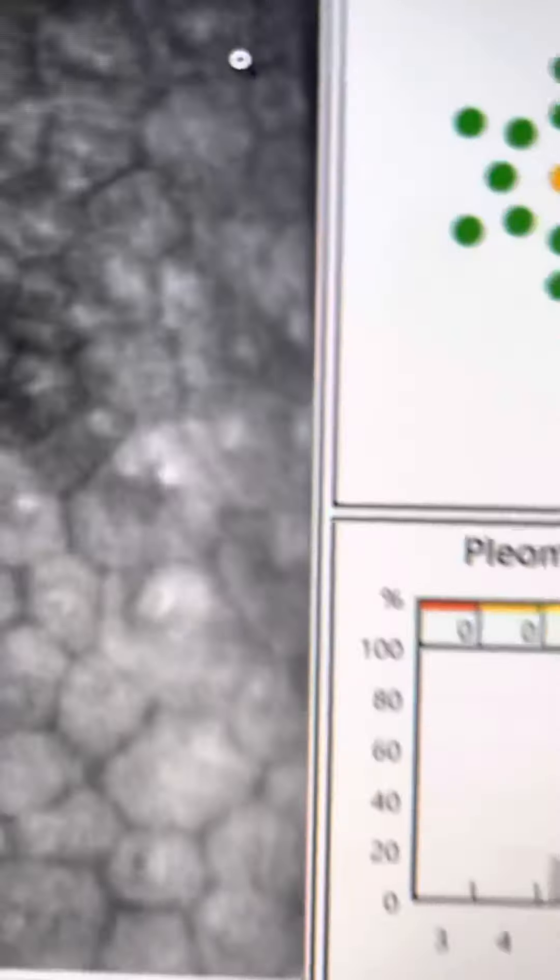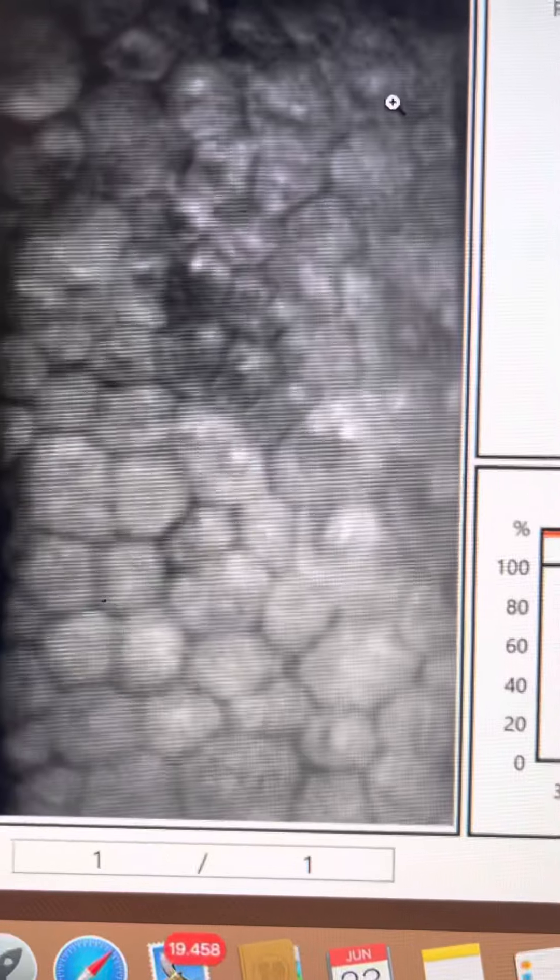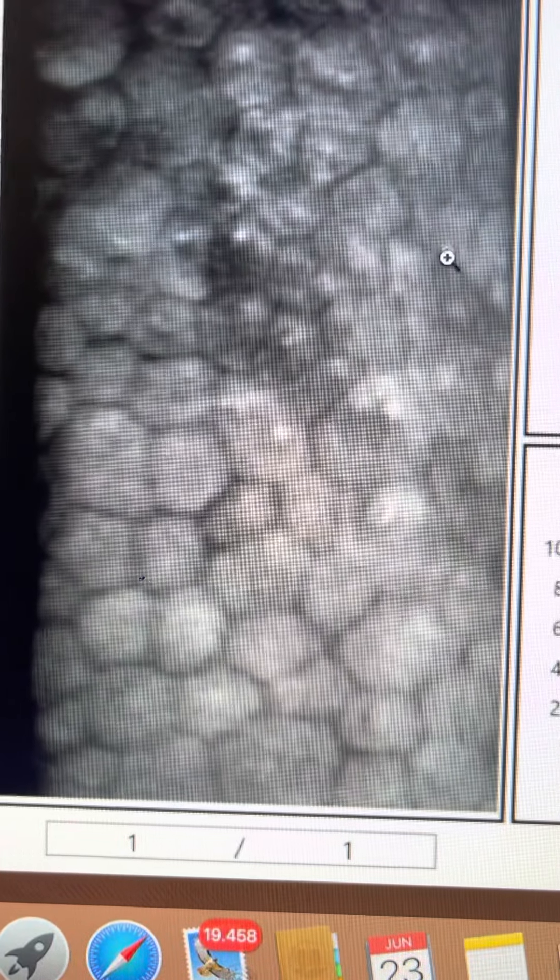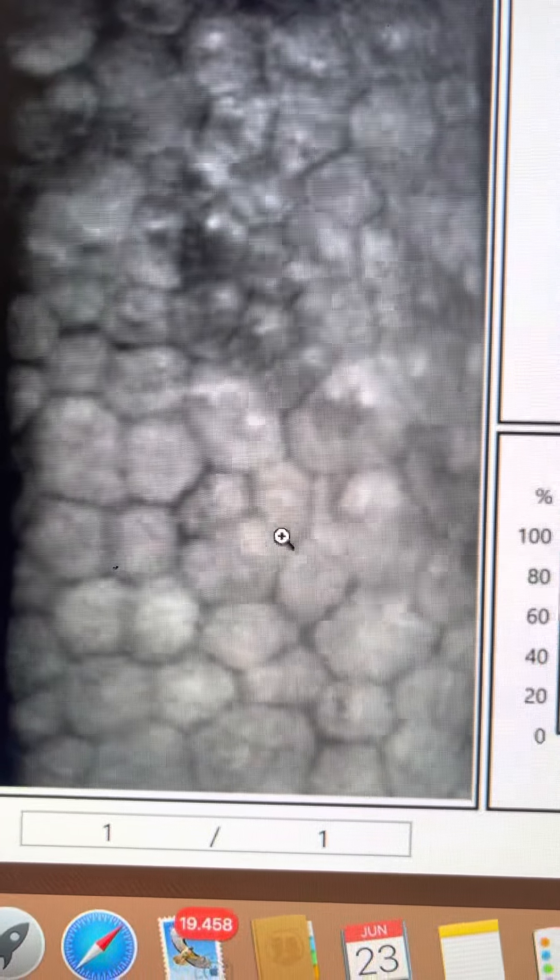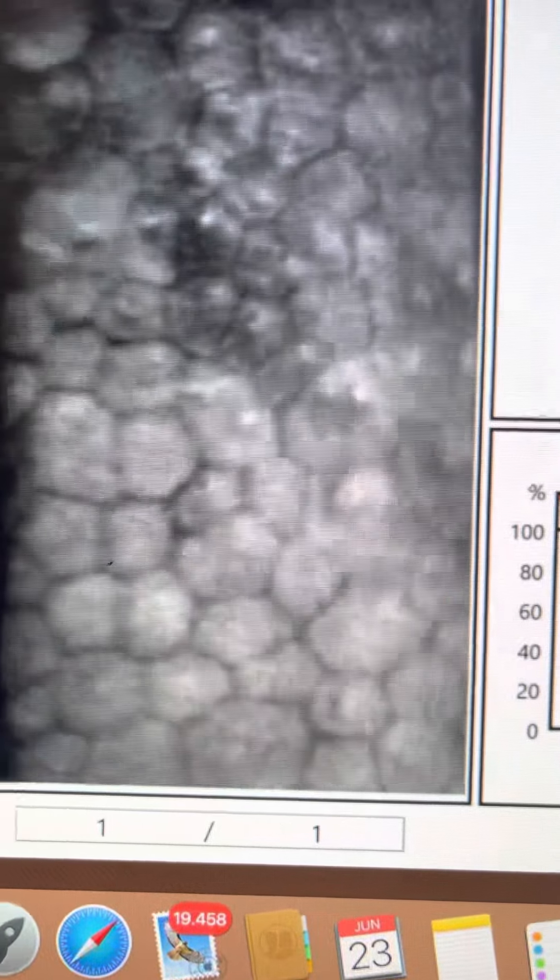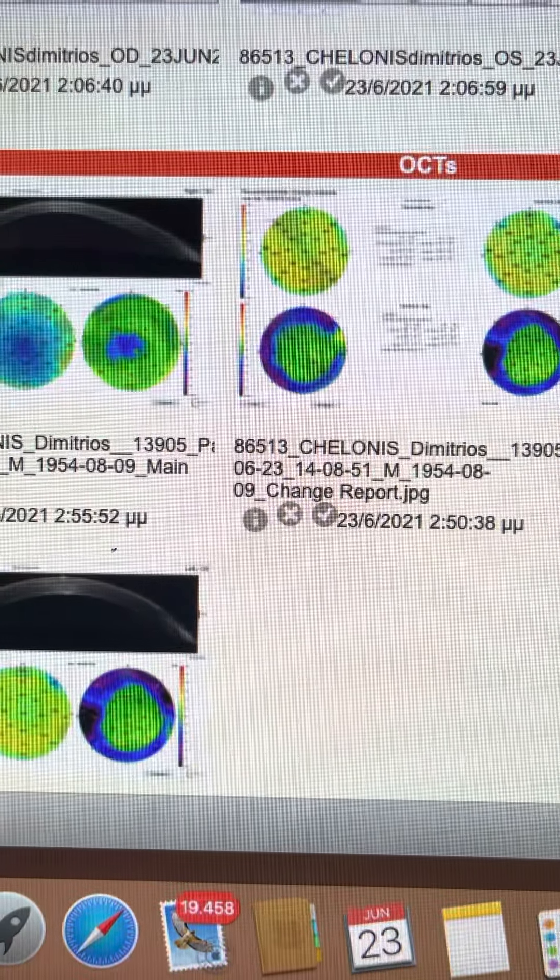The other thing of interest here is to look at the endothelial cell count on the transplant. It reads over 900. The cells are pretty regular. Some polymegathism, but there's no active cell loss here in my opinion.